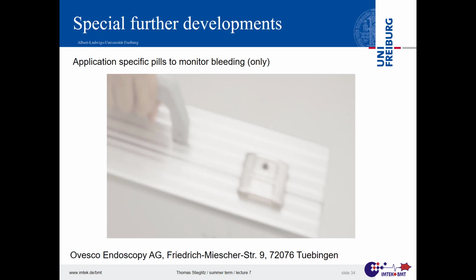Once heard a talk of that guy, but he did not share the slides. So the first prototypes were really garage-like. They had two light diodes and some breadboards to place all the components, and then they took a droplet of blood and said, hey, this is blood, and then they took a lot of other things and said, oh, no detection. And then they integrated that and really made it to the market in a relatively short timeline.